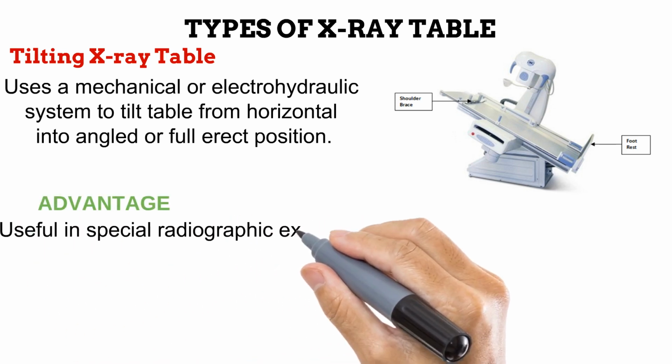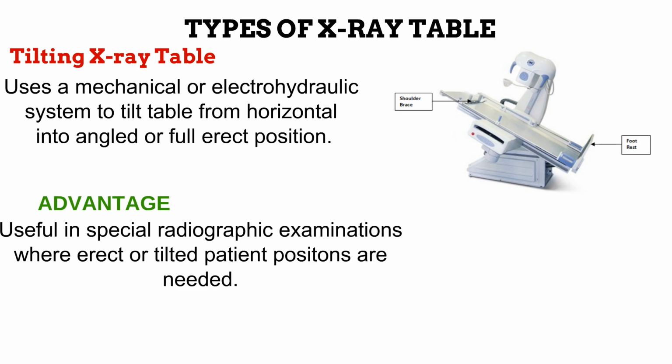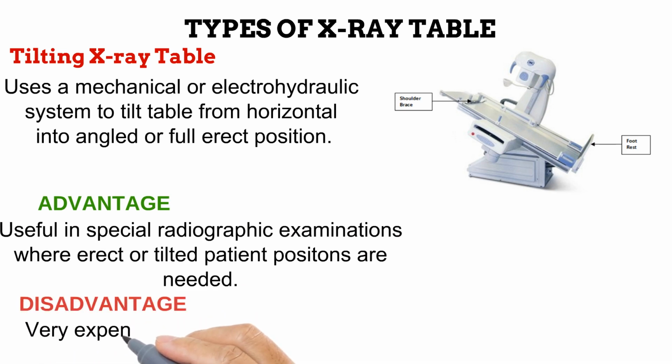The major advantage of this table is that its wide range of movement makes it useful in special radiographic exams where the patient needs to assume different positions. However, these are the most expensive types of tables.